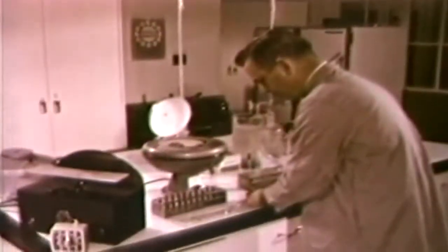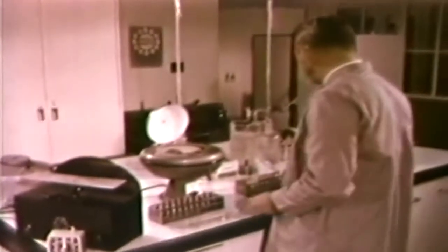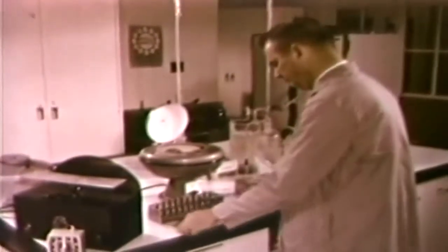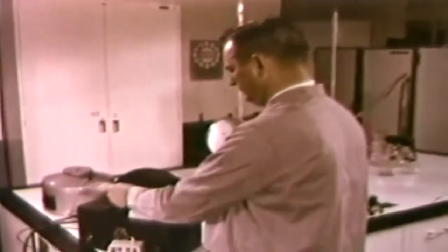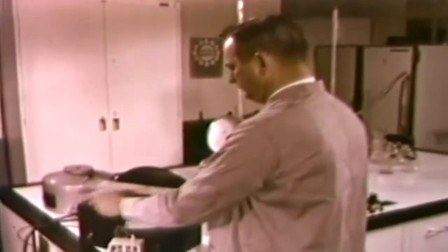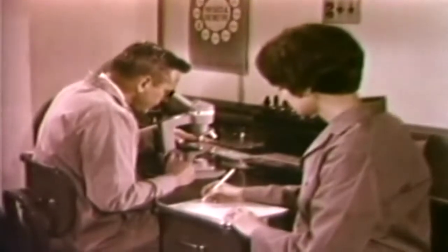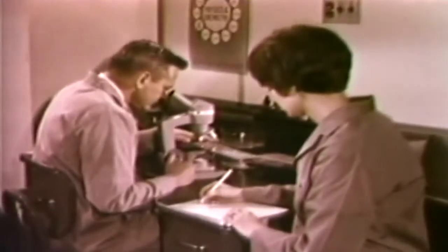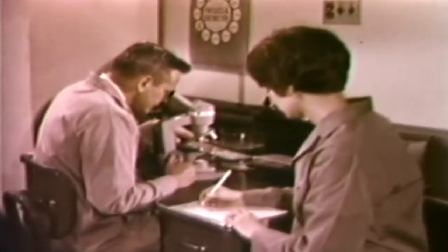The grouping samples were also centrifuged. Now they have been placed in the wells of a grouping slide, and known blood cells are added. Again, agitation speeds up the reaction time, and the slide is now ready. The next step is to determine to what group this human blood belongs. The examiner reads each recess of the slide microscopically. The result tells the group of the blood stains on the suspect's shirt.